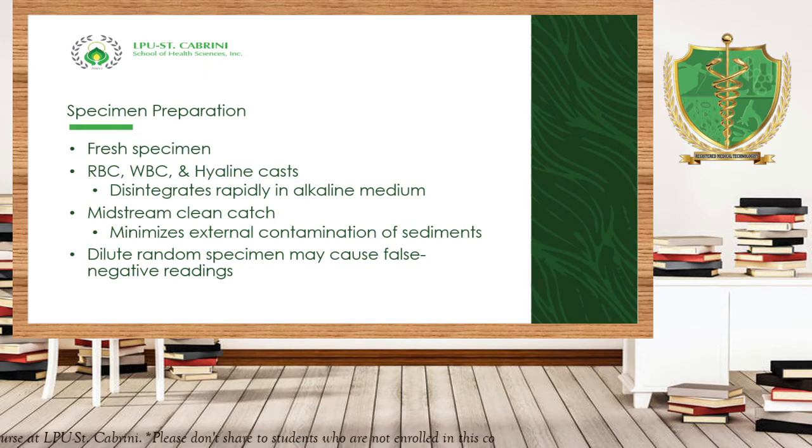Now, going back to what I am saying, if we let our urine stand in room temperature, definitely there will be a change in the pH. Ano yung mangyayari sa pH? Tataas yan, right? Tataas ang pH. Okay? So pag tumaas ang pH, it will also affect the microscopic examination of the urine, not only the chemical examination of the urine, but also the physical examination.